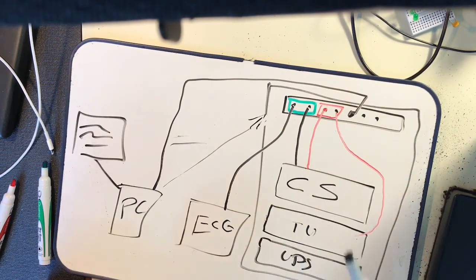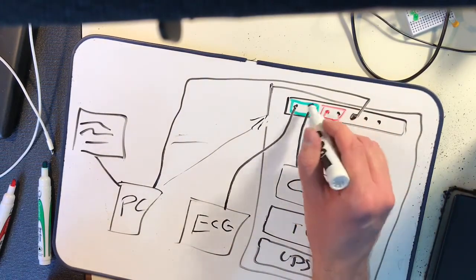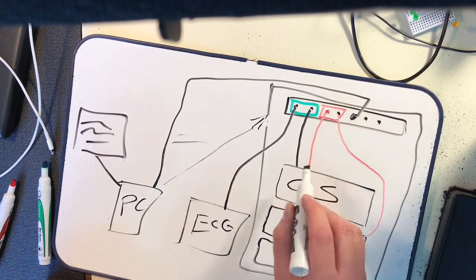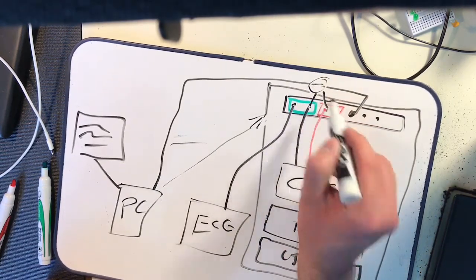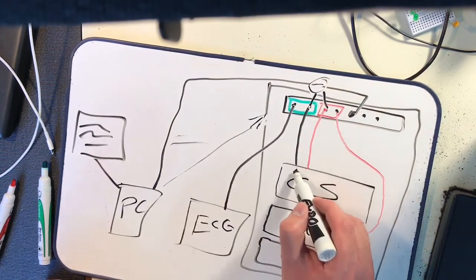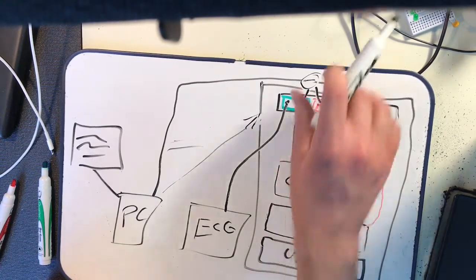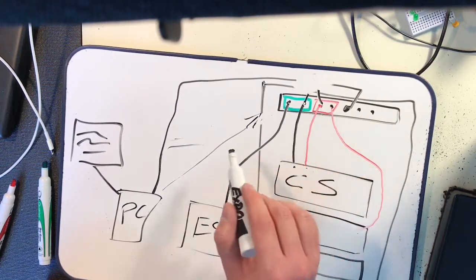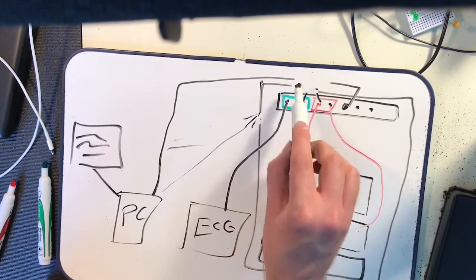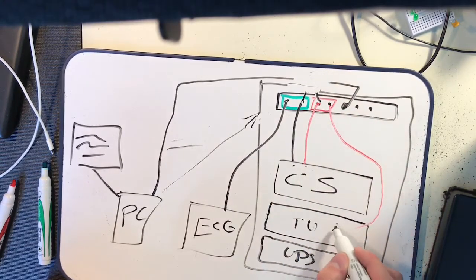I hope this gives an example or an idea of what VLANs are, why they are used, and how they're used in BMET. You can see here that we have the two virtual switches on two different networks. So if these wanted to talk to each other, we need to have something up here like a router to connect these two together. Or the central station would need to bridge the connections or route the connections because the switch isn't able to do that. But we don't currently have that set up. So right now, these are just two isolated networks that aren't talking to each other. And that's sort of how it's supposed to be in the documentation for the telemetry unit.